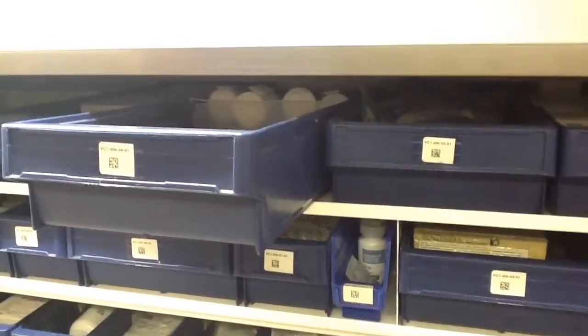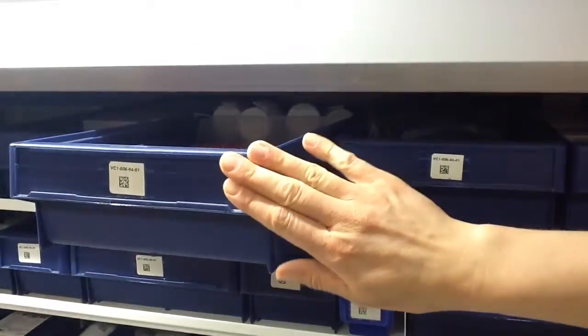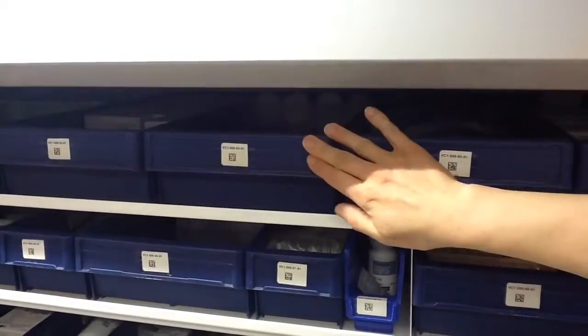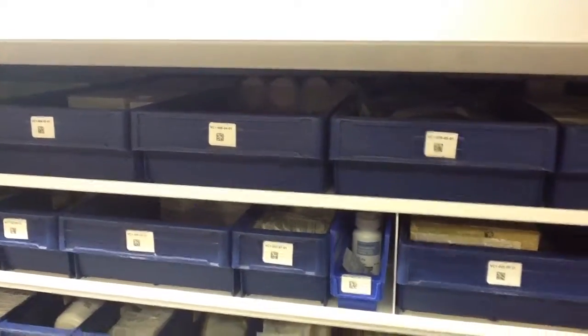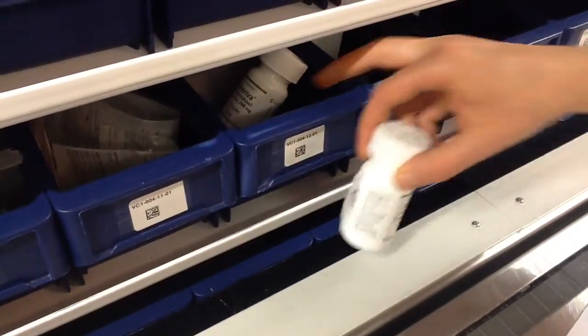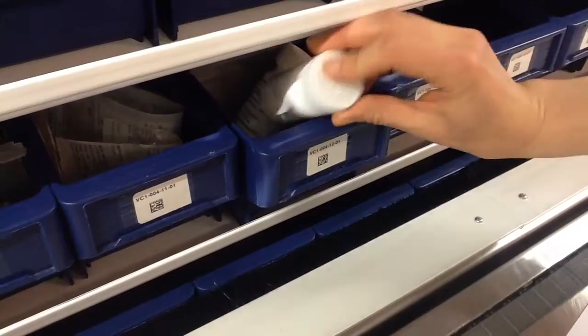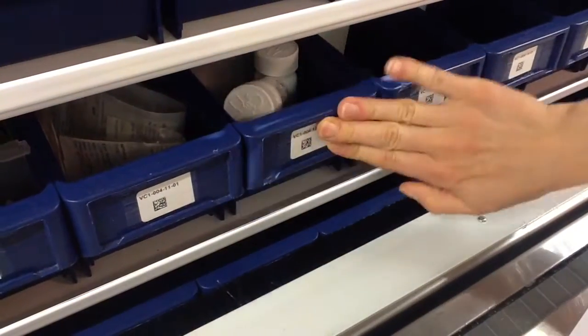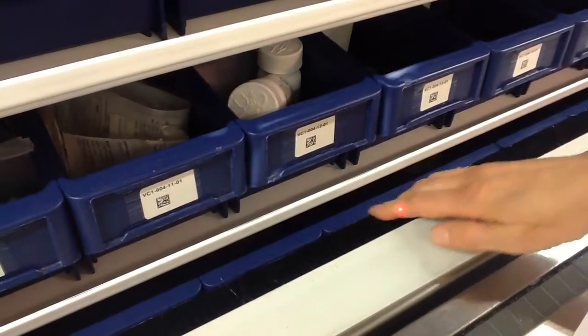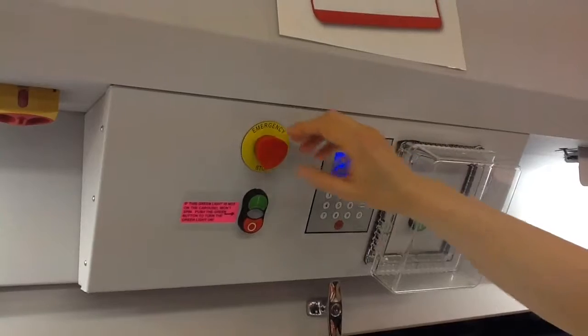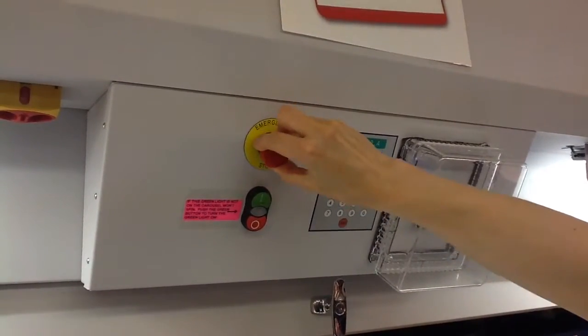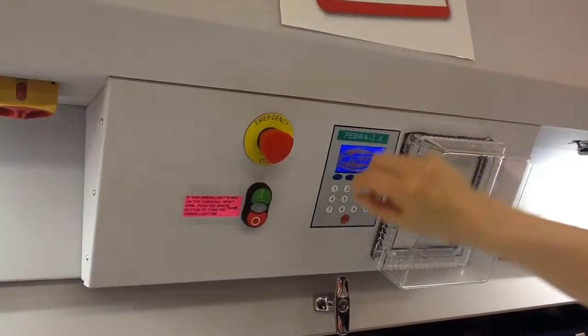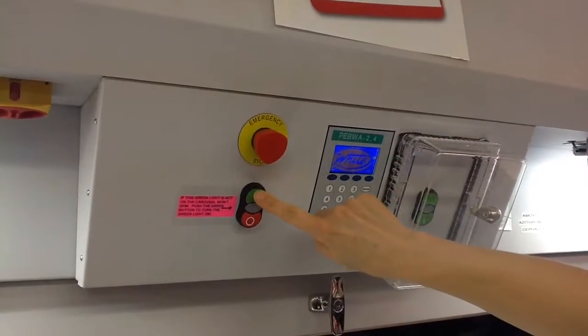To allow the carousel to spin again, clear the obstruction by replacing the bin or product, clear the bristles or release emergency power button, turn and pull button out. Press the green button to turn the carousel back on.